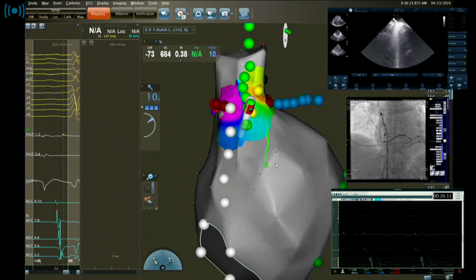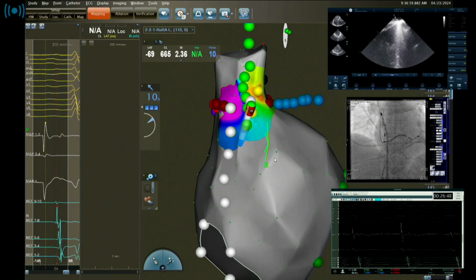Again, I explain because people don't believe. They all the time demand some randomized study data, but I don't want to randomize my patients because I know already what I can get from intracardiac echo. I believe it will be unfair to expose half of my patients to somebody who does not believe, just to increase the risk of any complication or failure of the procedure because somebody wants to see what is obvious. If you're seeing all these structures, it must be better than if you do it blindly, more or less.